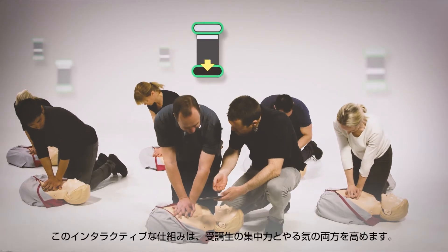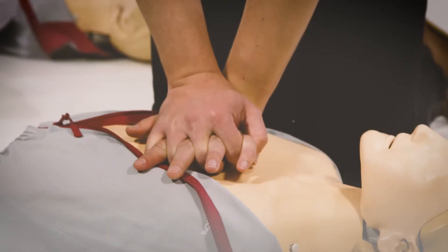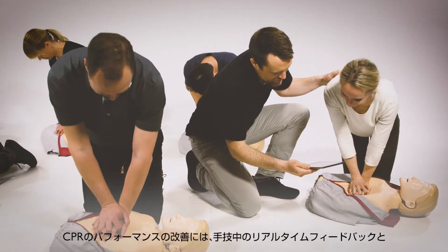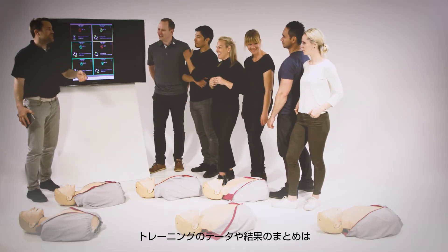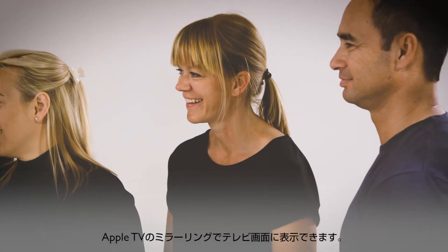The interactive element improves both learner engagement and motivation. Both real-time feedback during the session and debriefing afterwards are valuable tools for improving CPR performance. You can display your training and debriefing sessions on a television screen using Apple TV screen mirroring.